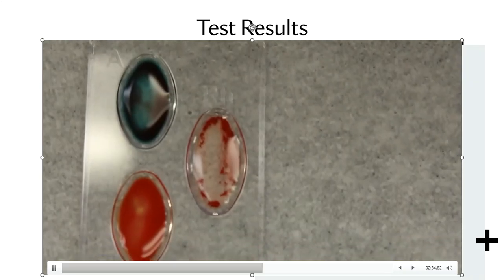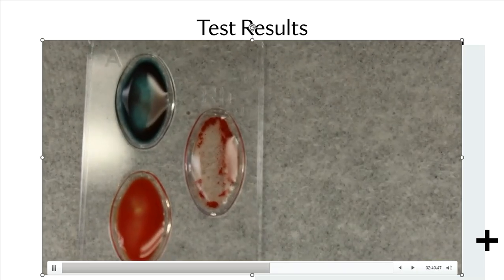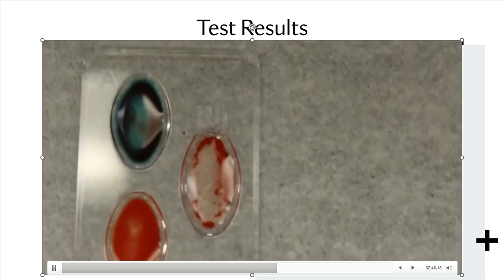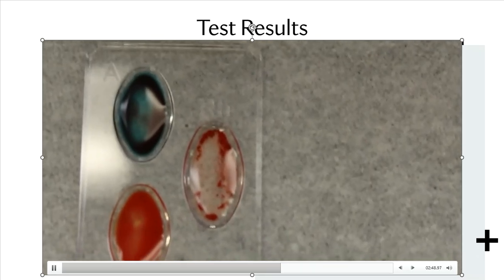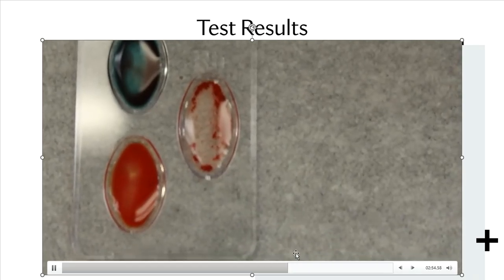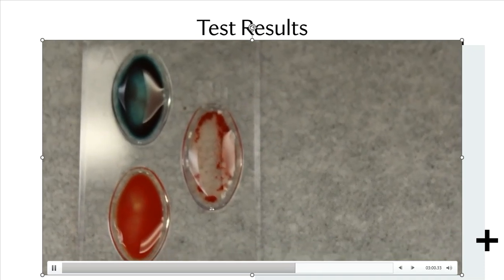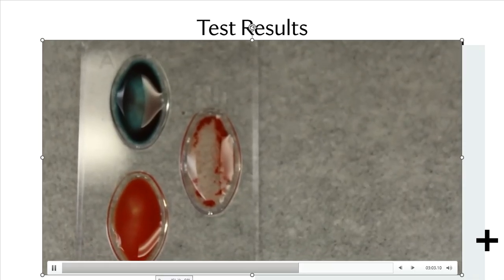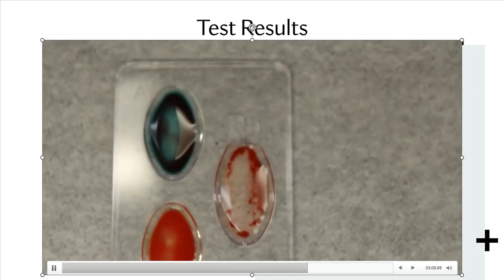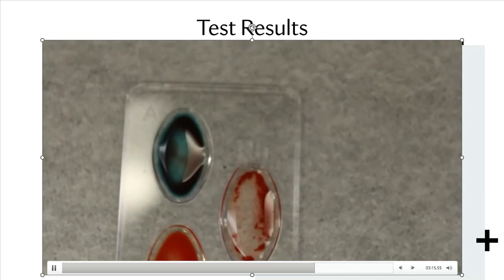And at the end of this particular lab, when you do it, we want you to go ahead and take a picture of the blood well so that we can make sure that you read your own blood type the proper way. All right, so that's it with this particular lab. Again, very short, very sweet. We just want you to come in, go through the motions, and figure out what your own blood type is using real antibodies. After that, we will begin blood typing other people's blood samples in a different part of the lab experiment.